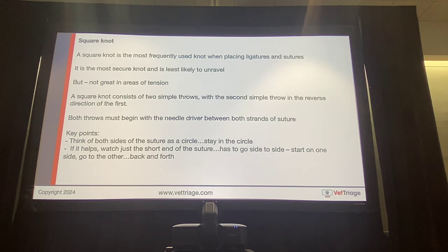So this is how you're gonna hold these, right? And then this is to grab the prosthetic skin layers, as well as your needle and the thread. So we'll go over what a square knot is now, and it'll make more sense when I show you pictures and videos.